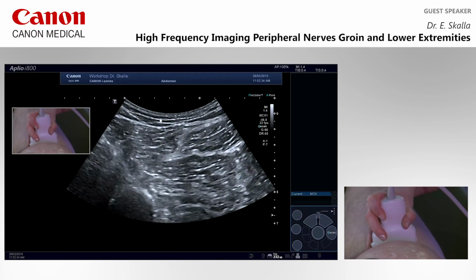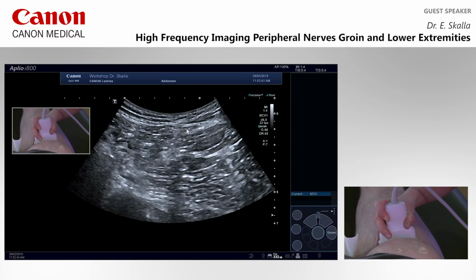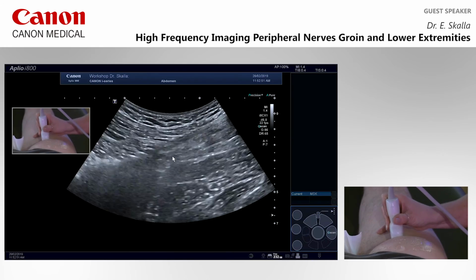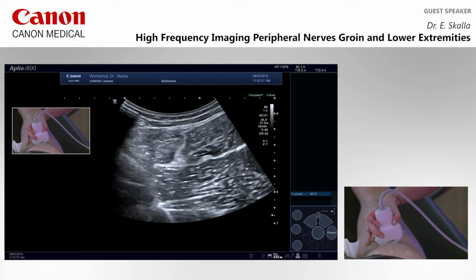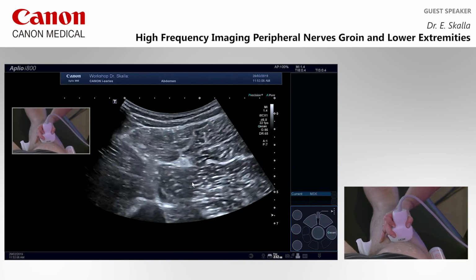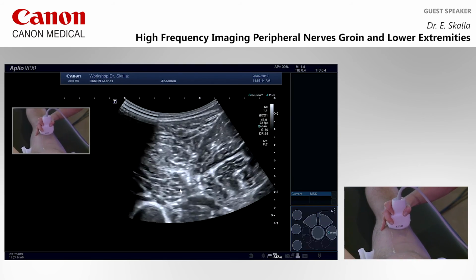And then we have the long head of the biceps muscle, here, other side. This is the adductor muscle, semitendinosus and semimembranosus, and here the long head of the biceps muscle, and in between this huge nerve, you can also have a longitudinal view of it, the sciatic nerve, and we can follow it downwards, just in the center of the thigh, when we have enough gel. Straight downwards, and anyway, here we should see the bifurcation in the 2 branches.